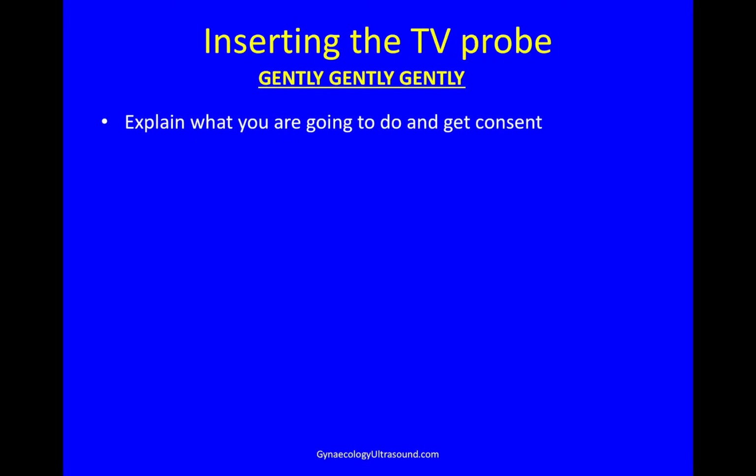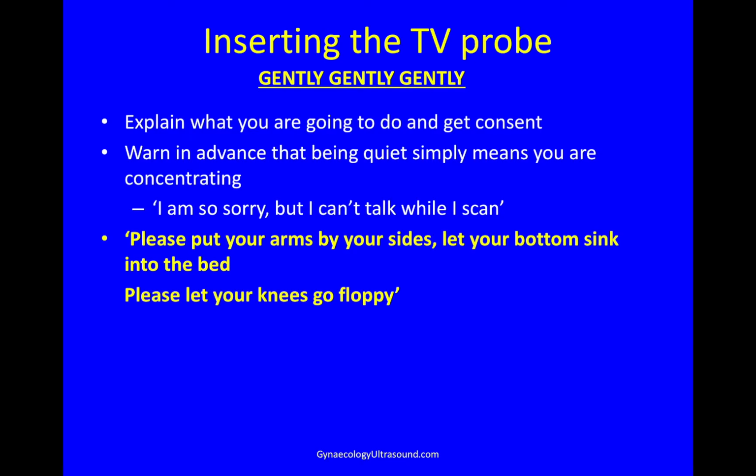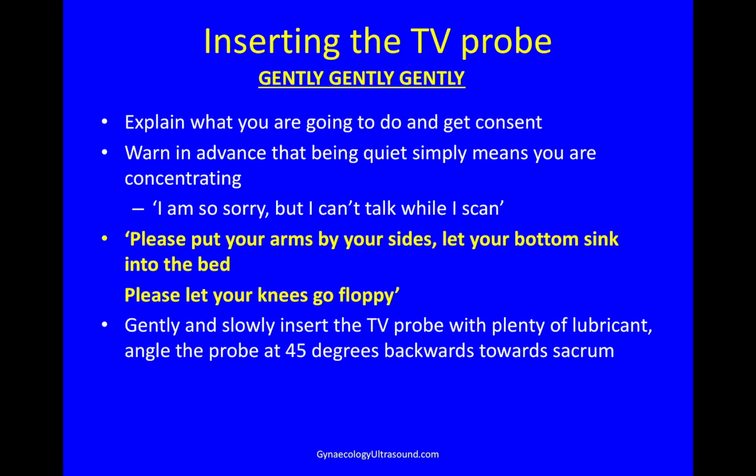You need to be super gentle with patients with endometriosis because they've already had a lot of pelvic pain, and explain what you're going to do and get consent. And I warn them in advance that when I'm quiet, it just means I'm concentrating, and I say, I'm so sorry, but I can't talk while I scan. And then I ask them to put their arms by their sides, let the bottom sink into the bed, and let your knees go floppy. This makes a huge difference. Then gently and slowly insert the probe with plenty of lubricant on the outside of the probe, angle the probe backwards toward the sacrum, and do a normal systematic pelvic ultrasound.